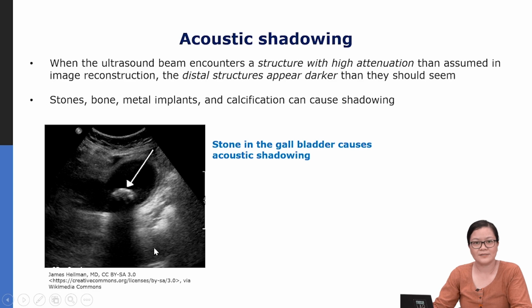Stones don't only cause this effect. Bone also causes the effect because of its high acoustic impedance mismatch with other soft tissues. Metal implants also cause this effect, as well as any calcification that occurs in the body.